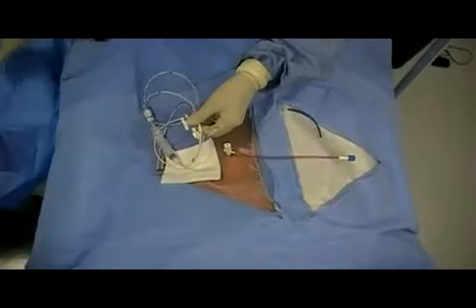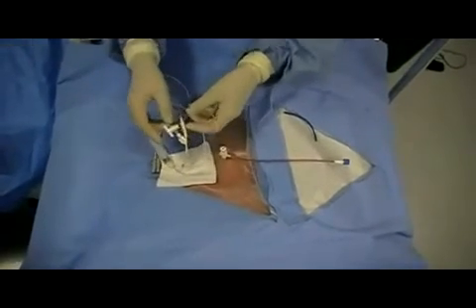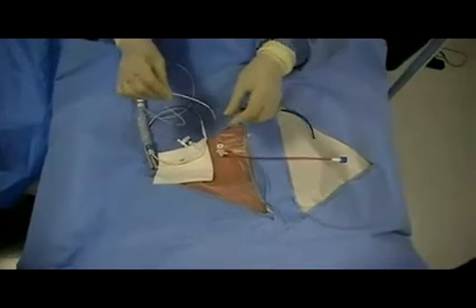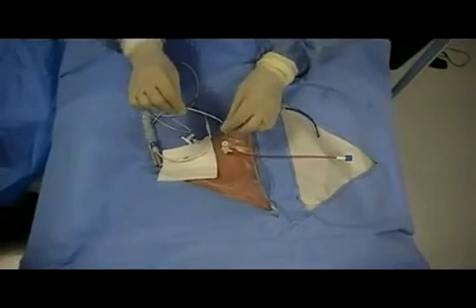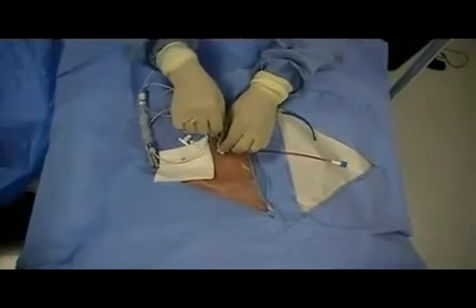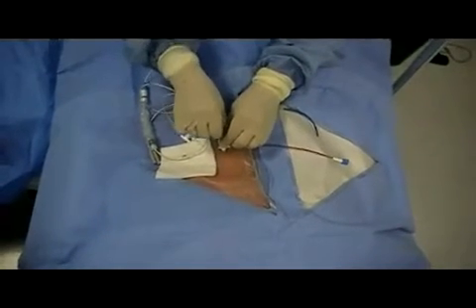At this point, the pacing wire should be inserted into the patient. Follow the curvature of the wire. Advance the catheter to a length of 20 cm and inflate the balloon.